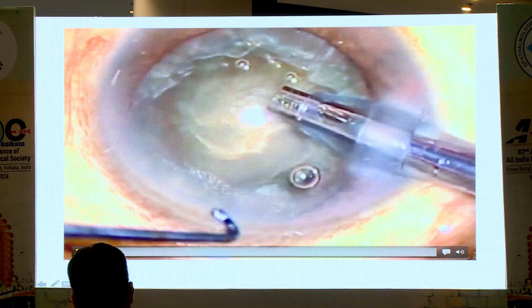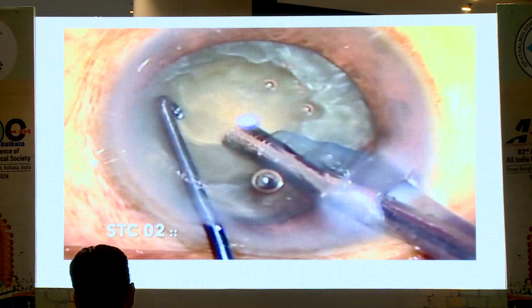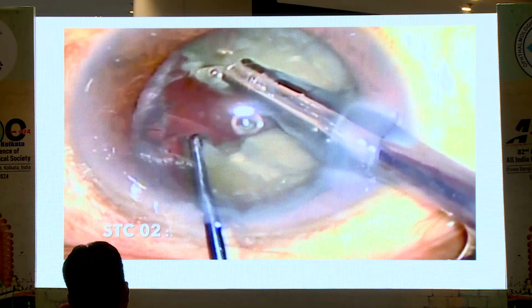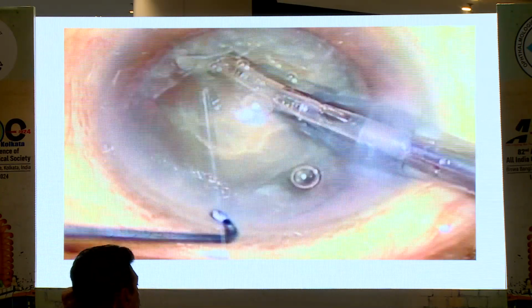A little bit softer cataract. Only superficial impalement. The terminator chopper goes behind, and you can see very easily into two heminuclei without any fuss.